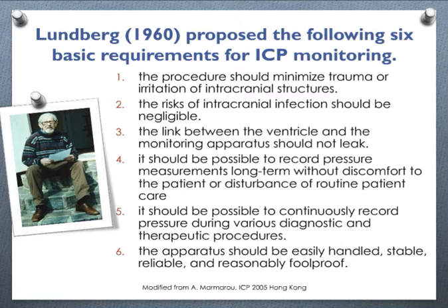It is not a snapshot. We are talking about the 60s. He wanted to have a long-term recording, and during diagnostic and therapeutic procedures, also in transport today, we need to have ICP. And the apparatus needs to be very easy to use and foolproof.